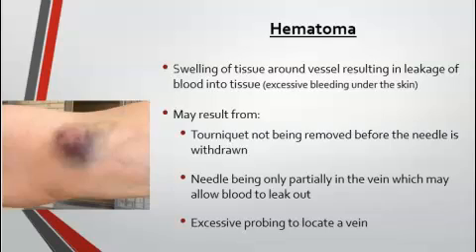One trick that we can do that can sometimes help or prevent a hematoma or a bruise from forming is just to hold pressure for an extended amount of time on the puncture site, and hopefully that will help reduce the risk of a hematoma forming.